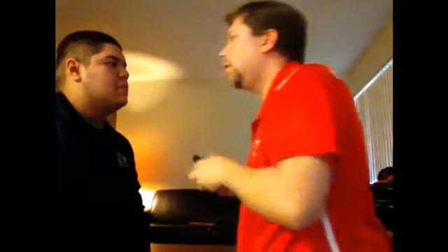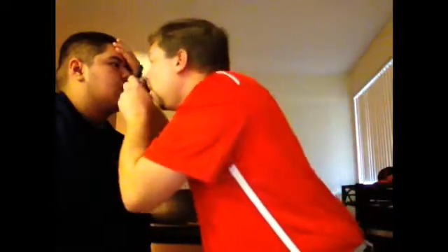Okay. Alright. So it's a superficial view, making sure that you look through the scope and you get pretty close to get a full view of what's going on. Everything's intact there.